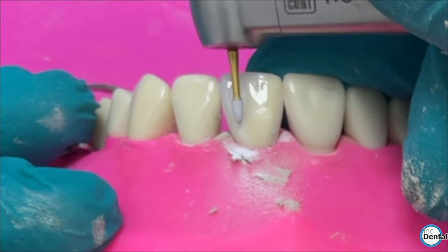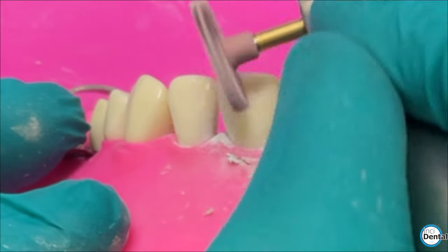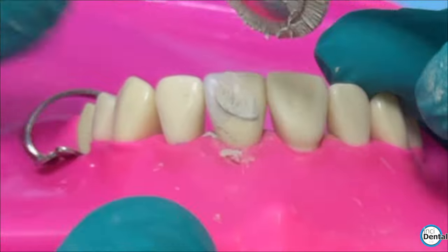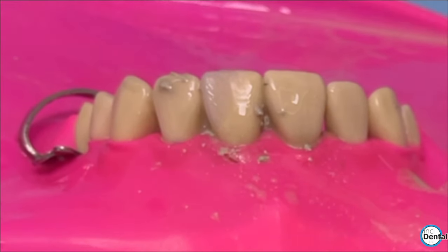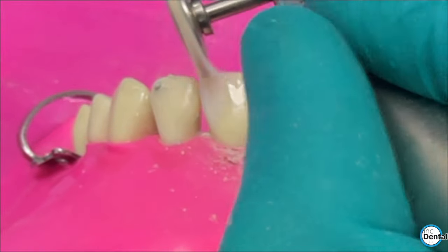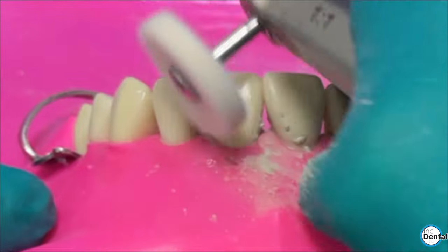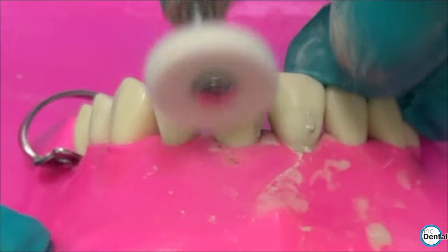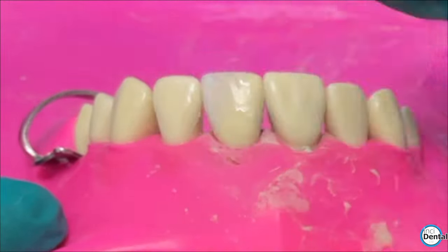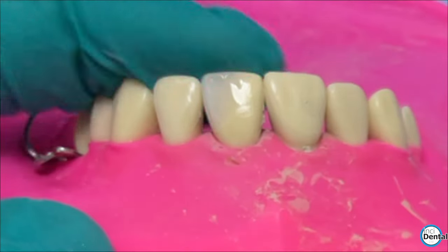For the demonstration I wasn't quite happy with the length of the lobe distally — it felt a bit short and made the reflection look a bit funny — so I've just lengthened and softened it slightly with the torpedo bur. When you make a little change like that during polishing you go back a few steps. I do the paste dry generally and work that back in with the goat's head brush. Sometimes this makes it look a little rougher even than the EVE fine polish, but the last piece de resistance is going in with felt mops from Mycerium. Light pressure, work them in, and it gives the best polish I've ever been able to get on an anterior restoration. The mandrel unscrews so you can put a new felt brush on when finished.